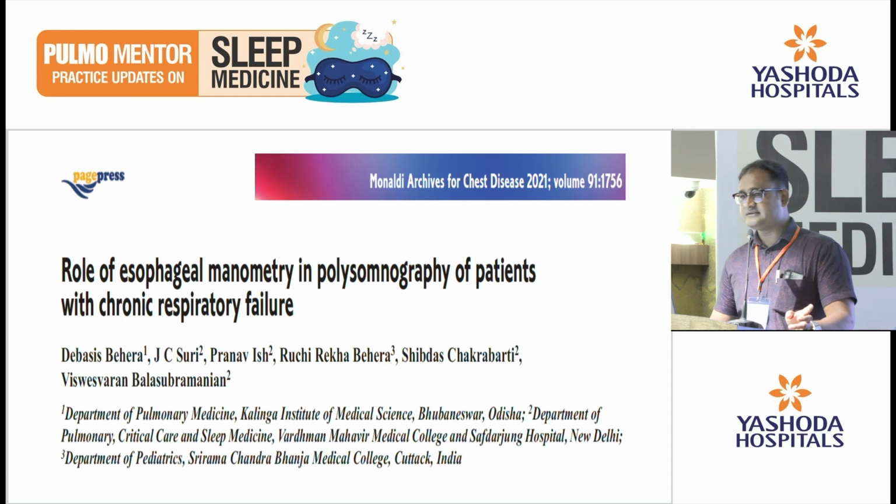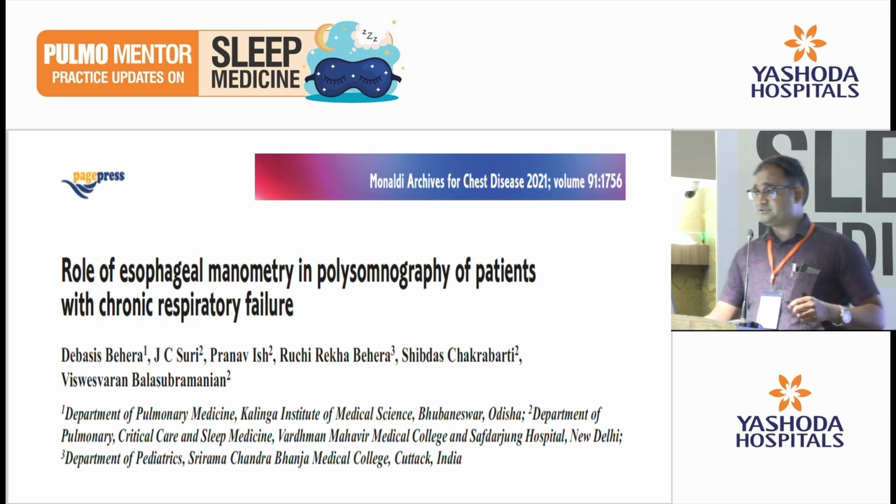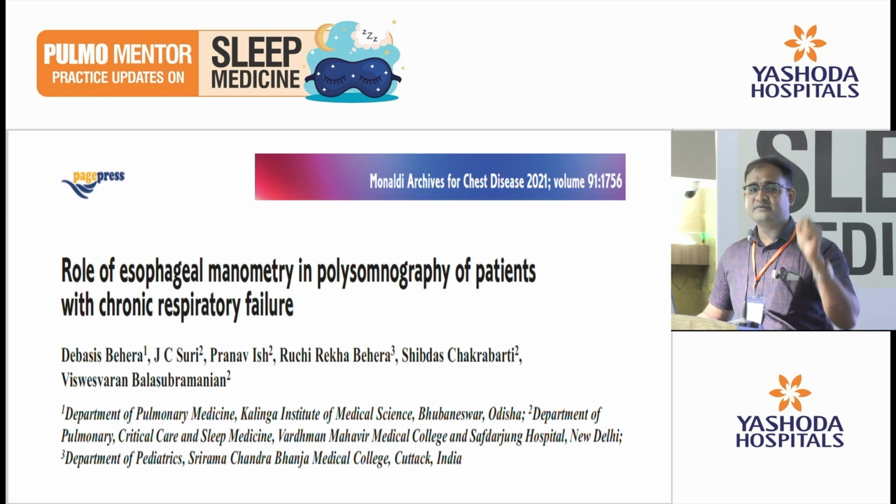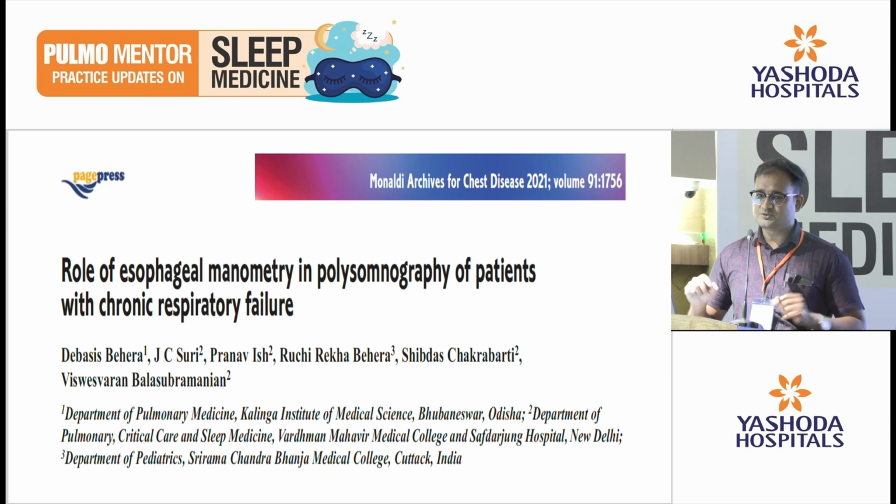Those who are interested can go through this paper, in which we have used esophageal manometry by putting an infant feeding tube inside the esophagus and attaching this infant feeding tube to an intra-arterial BP line. It can also detect esophageal pressure.